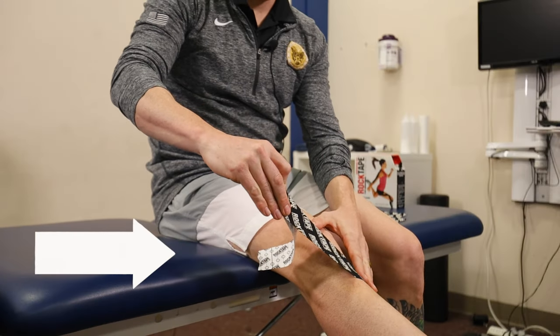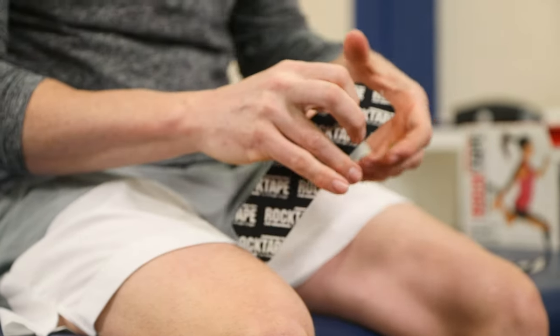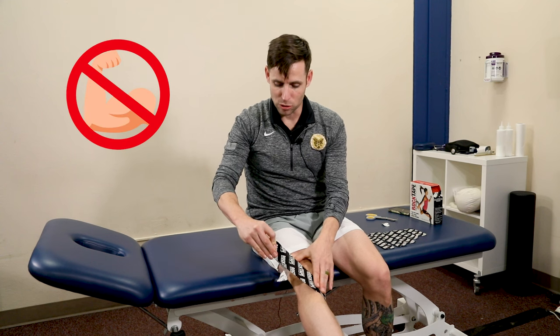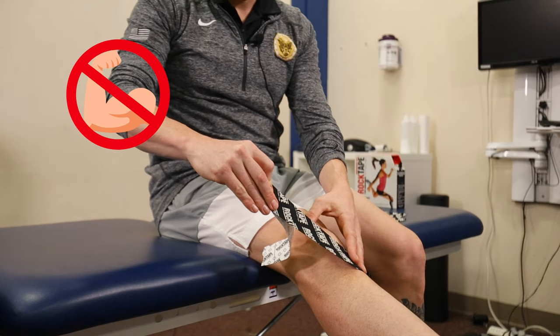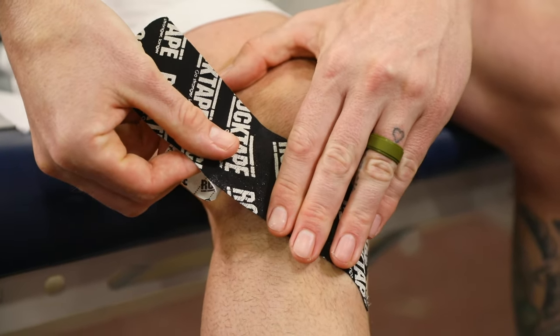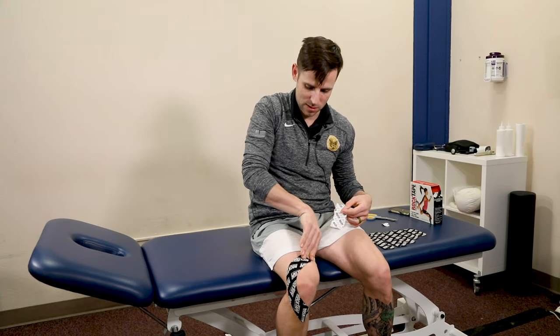Let's move into how to tape your knee yourself. We're going to start down here with the leg extended just like this. What we're going to do is slowly bend the knee as we apply a little bit of tension. We don't want to pull it too tight, but we do want to put just a little bit of tension here as we go over, slowly rounding as we come to the top.